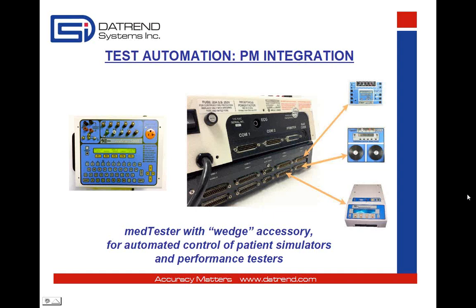like I said previously. Now, given that was done over 20 years ago, that was an advanced concept for its day. But more importantly, this was an open system that techs could make work with the test equipment from any manufacturer, provided the test equipment could be controlled from an RS-232 serial port.